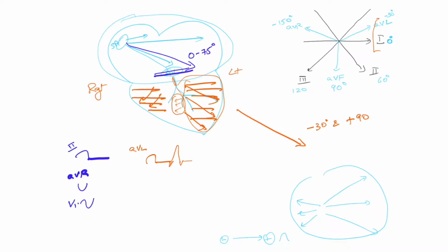Now, once that's done, because all the cells in the ventricles are depolarized, they would eventually repolarize. So you would have another wave like so, and this represents ventricular repolarization. We said this one is ventricular depolarization, and this one is atrial depolarization. Now, a couple of quick questions.